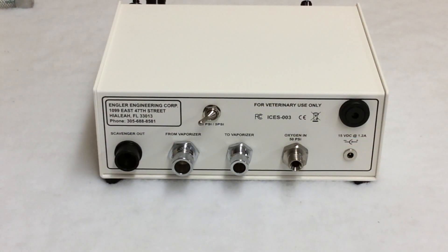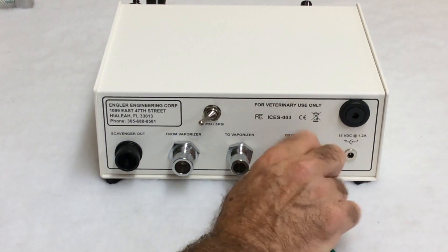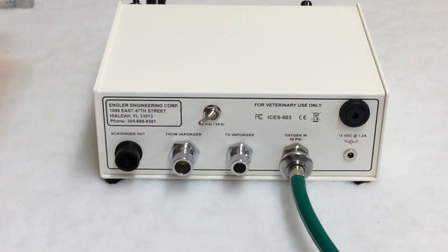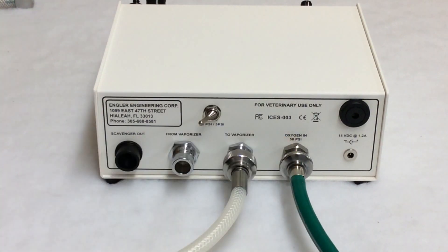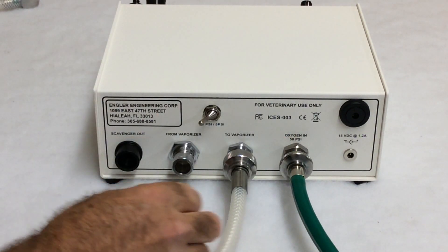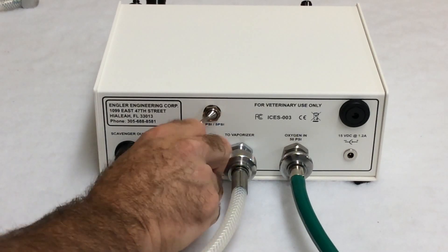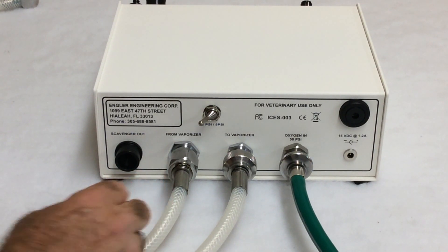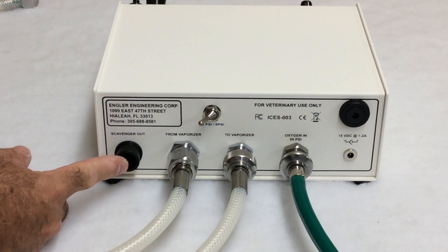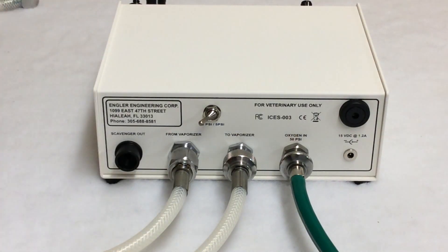This is how you connect the back of the ADS-2000. We have the gas sampling hose connection, and oxygen goes here. To the vaporizer goes here, and from the vaporizer goes here. If you'll notice, each port is a different size, so you'll never have to worry about confusing these connections. Here we have the scavenger out port. For this example, I have an F-Air canister which I will connect later.